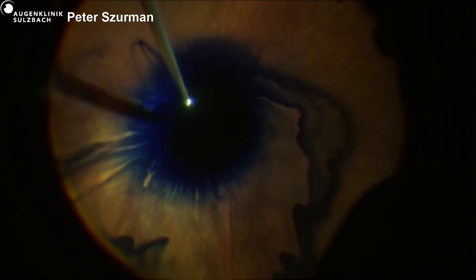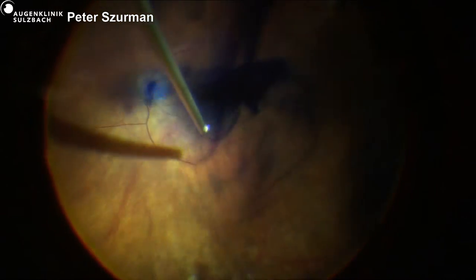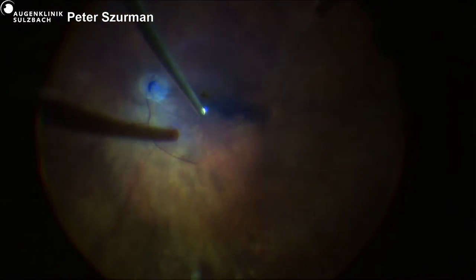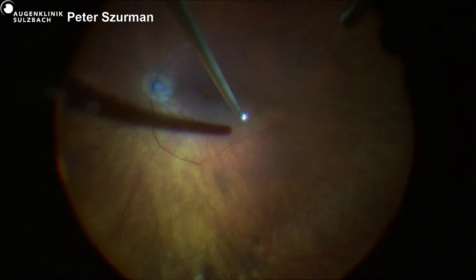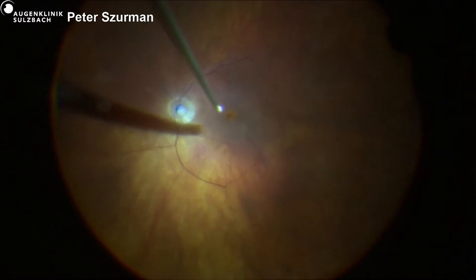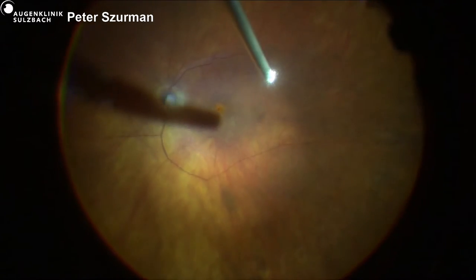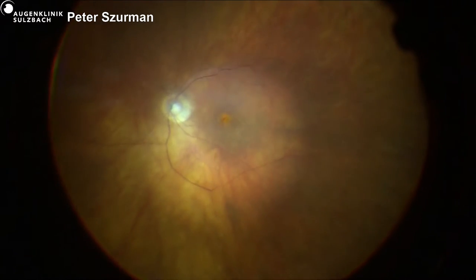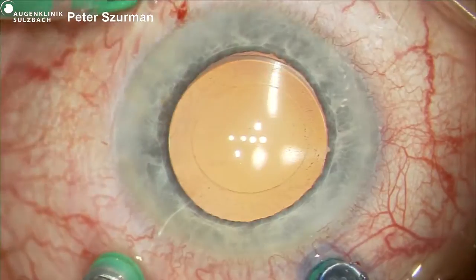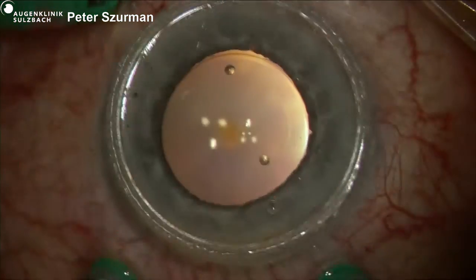What is the volume that you can aspirate, and how much can you draw up and push back? Quite a lot, because you aspirate and it remains in the tubing, and then you use the backflush of the system, a consistent reflux. It has a name in the machine, but I can't remember. As long as you push the button, you have a reflux of what you have in the tubing. And so you can inject how much you want.